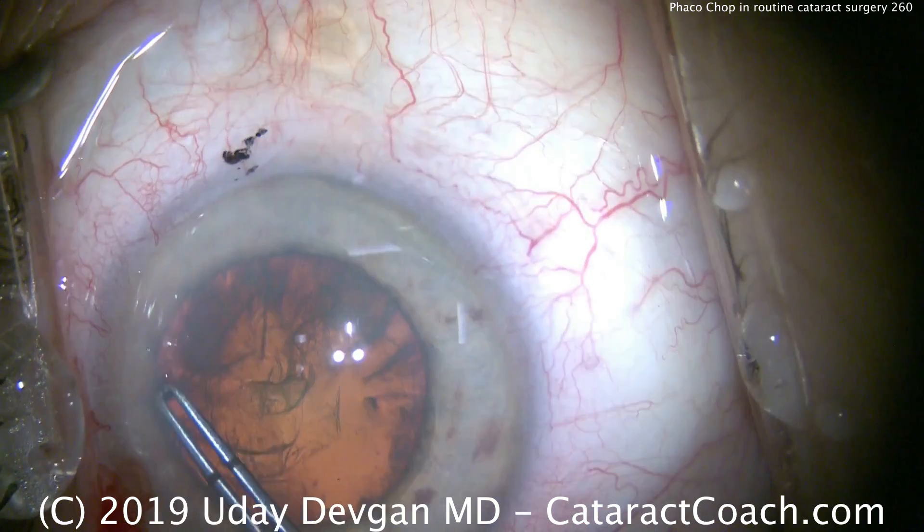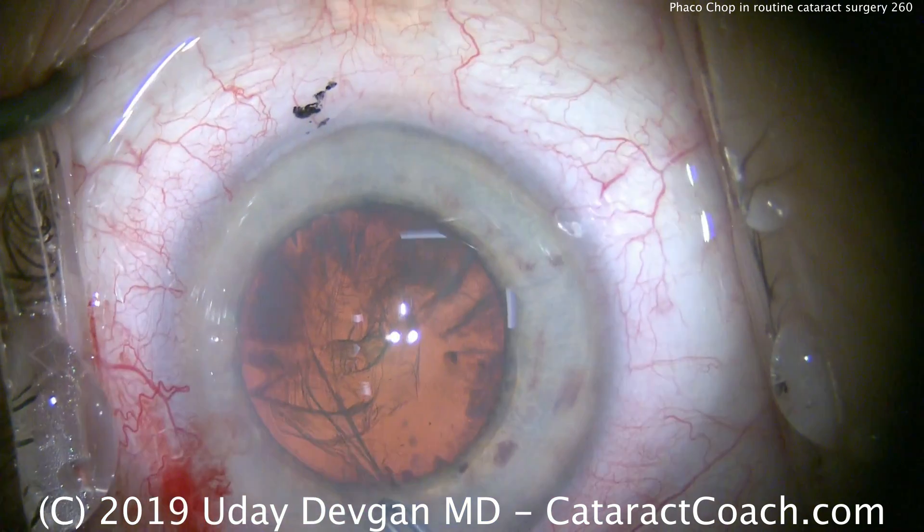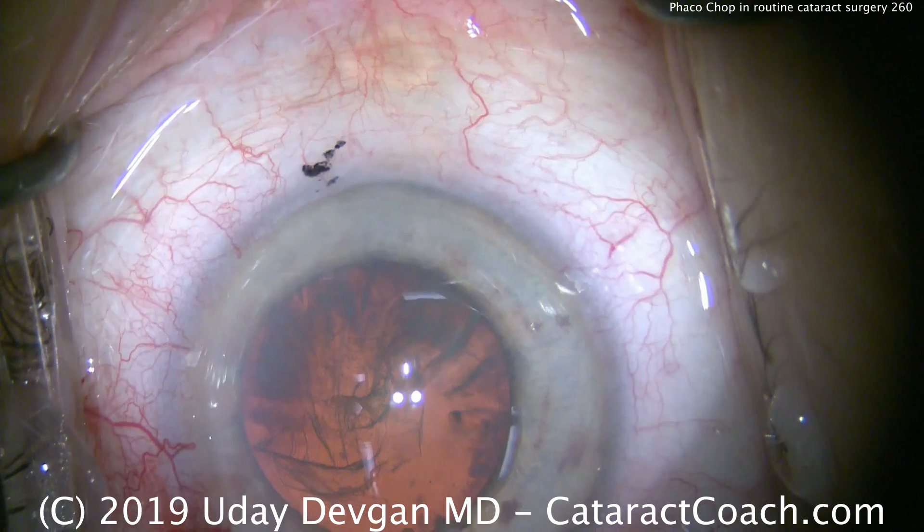When we go through the part of the cataract that has these opacities, don't let go. Don't lose sight of the rhexis edge, because it's very hard to re-grab it. There's our round rhexis completed.